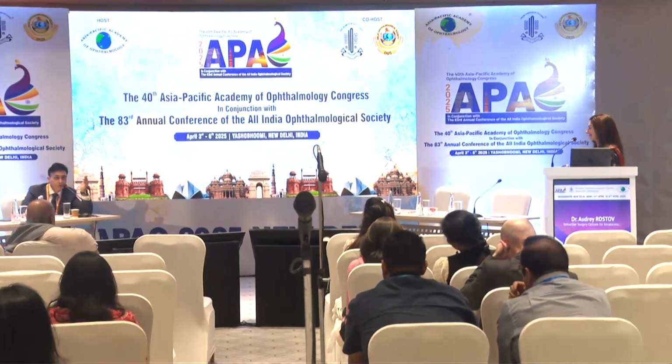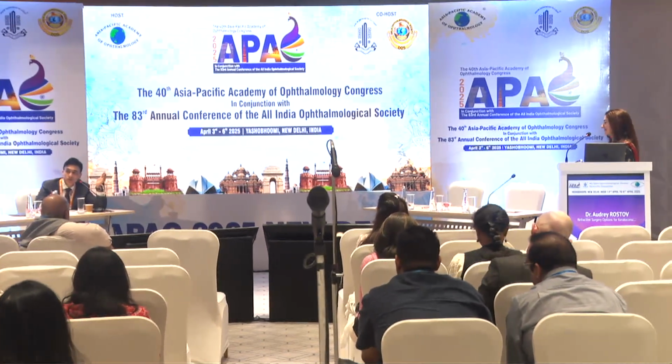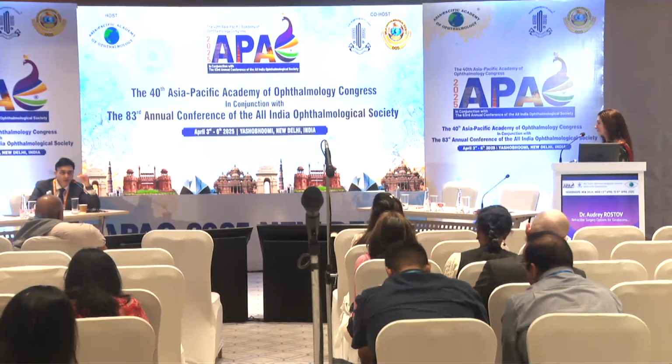One of the key things in doing cataracts in keratoconus is whether the patient's wearing a contact lens. That's the key thing, in my mind. If they're wearing a lens, you have a massive runway of what you're going to be able to achieve. That's going to give you the options and variables, and an idea of what lens you can then put inside the eye. And then you can take it from there.